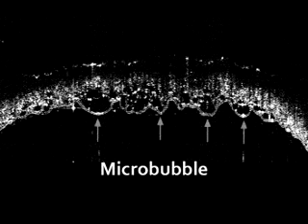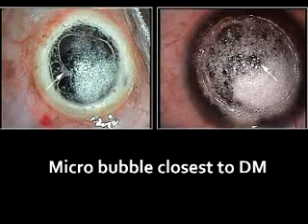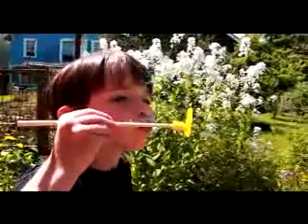Identification of the microbubble closest to Descemet is of paramount importance when the big bubble is not achieved, and this microbubble can help to preserve the most vital layer of the cornea successfully. Big is ideal, but if it does not turn out perfect every time, even the tiny microbubbles have power enough to deliver good outcomes.